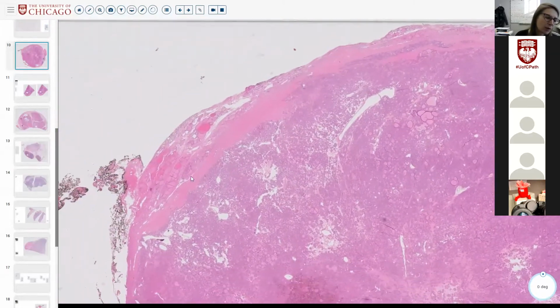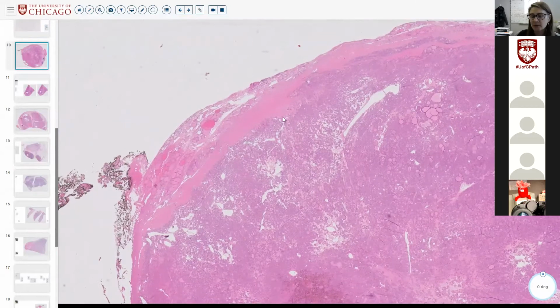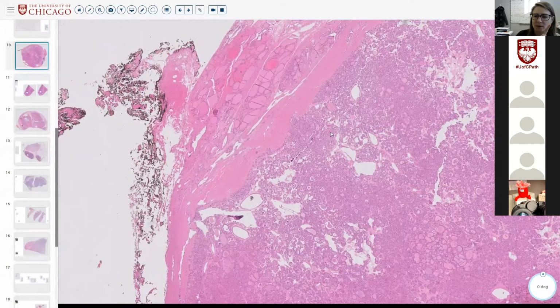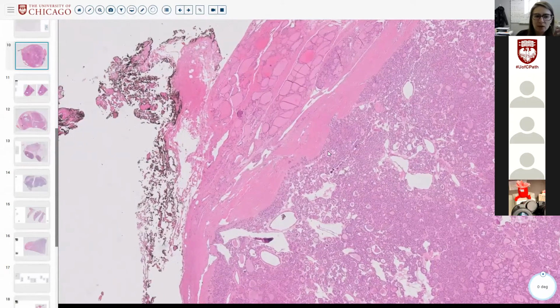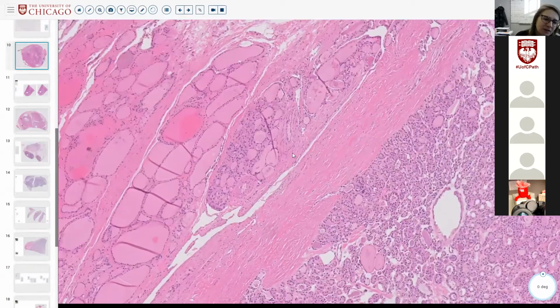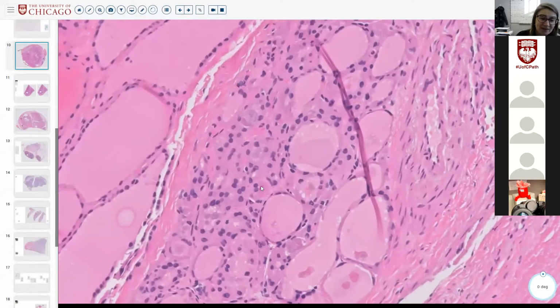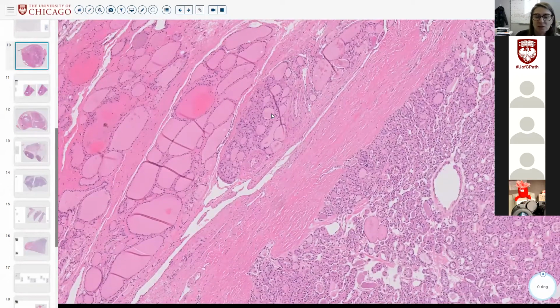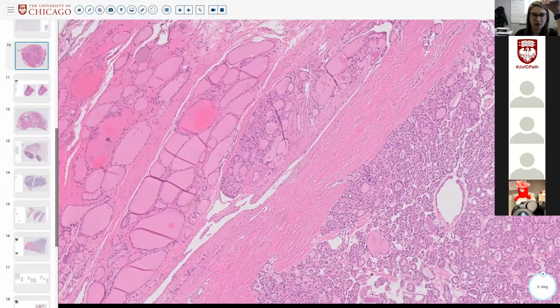Excellent. So what I might not call capsular invasion is on the other side, where you have little pokes into the capsule, but it doesn't end up on the other side. Now you have something that looks like maybe that's lesional, and it's on the other side of the capsule. So this could be the overhanging cap of a mushroom where you're just not seeing the stalk, right?